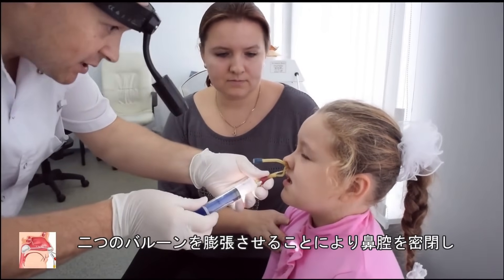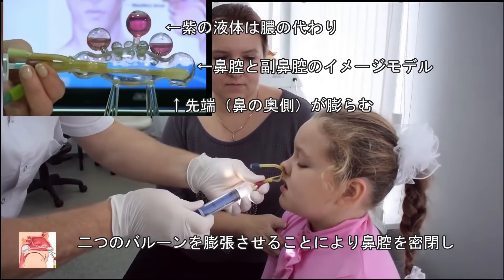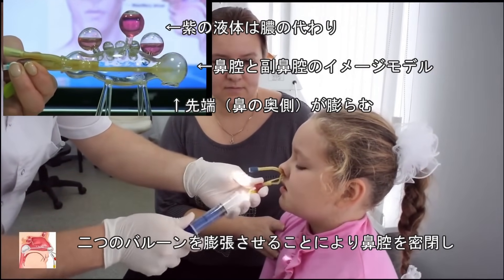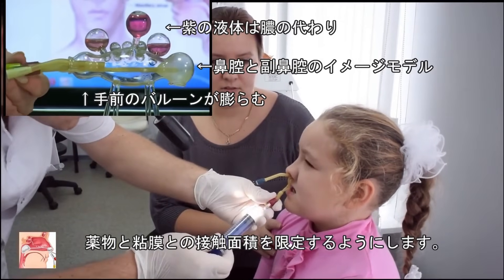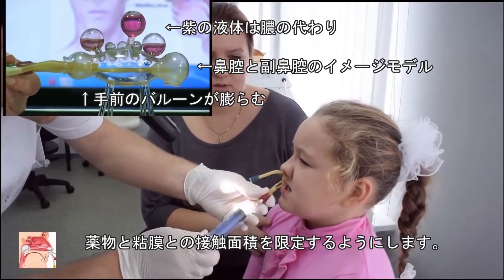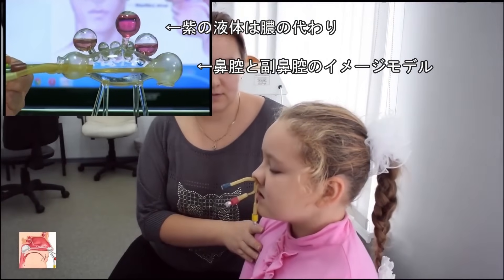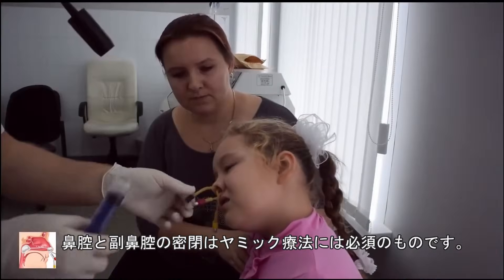Balloon inflation. The inflated balloons — one in the nasal vestibule and the other in the choana — seal and isolate the sinonasal cavity from the outer environment. They also restrict the contact area between the drug and the mucous membranes of the nose and paranasal sinuses.